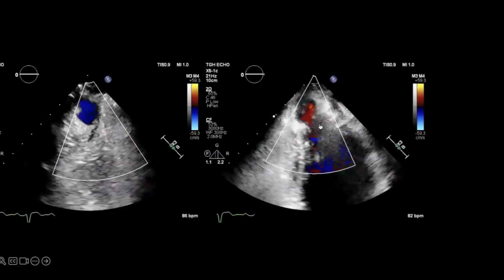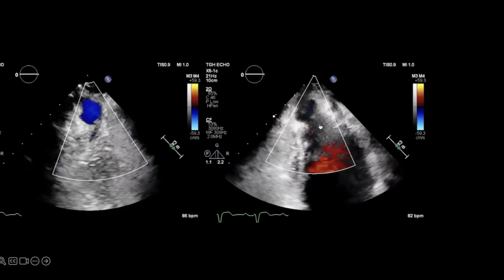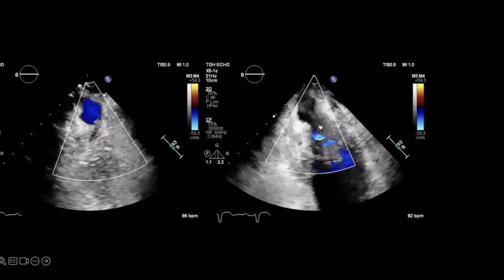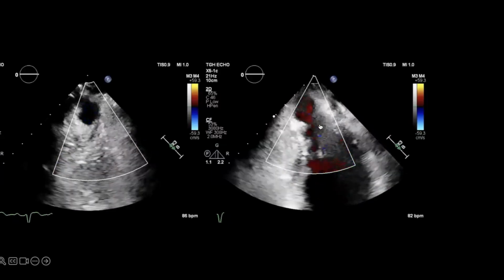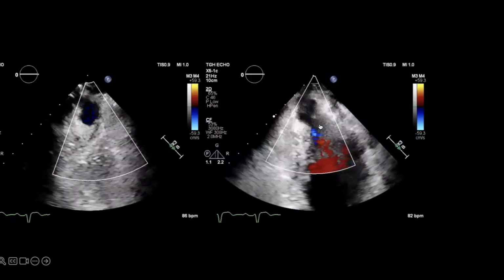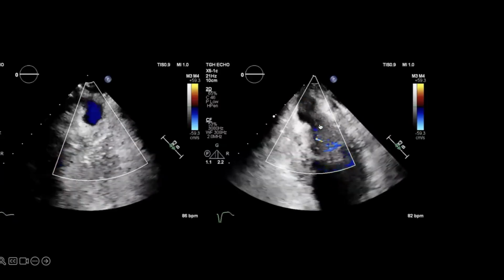See that blue flow, that would be diastole. Yeah, I think that bright flash of yellow is actually in diastole. That's the early diastole, that's the forward flow after it starts to relax. So that's diastolic obstruction.